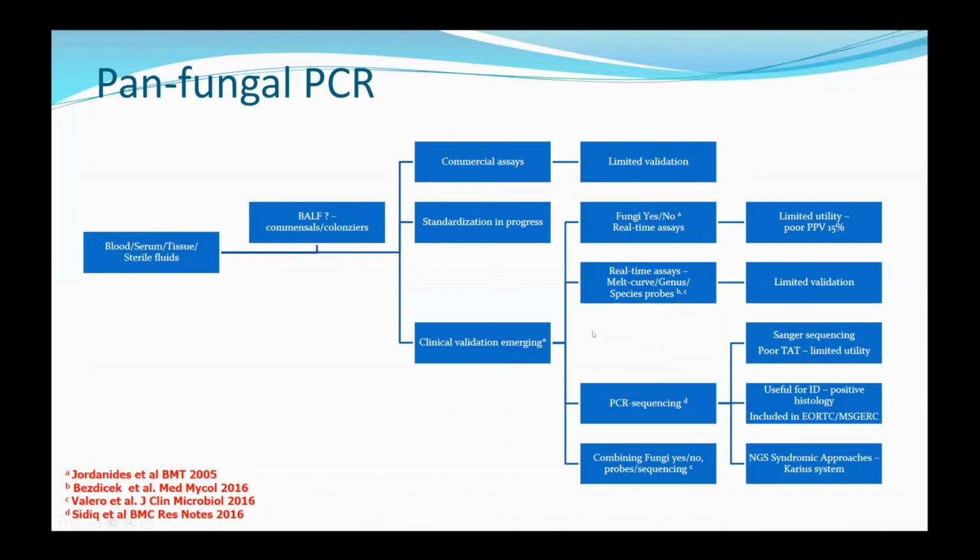But I think really for pan-fungal, we're probably going to have to combine this fungi yes/no as a frontline screen, and then provide some sort of etiological identification, whether that's through probes or through sequencing, to tell us what the actual fungus is.